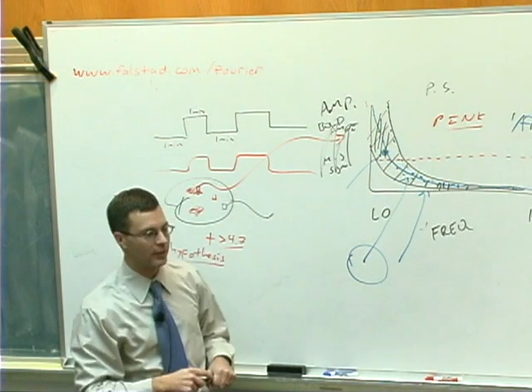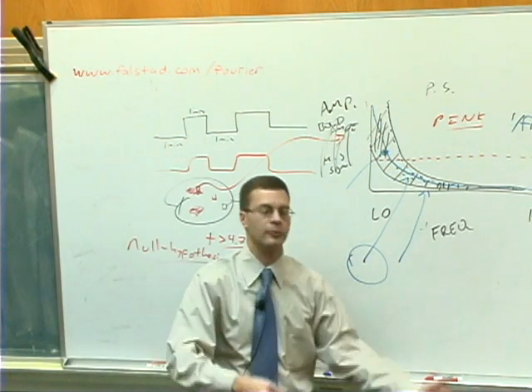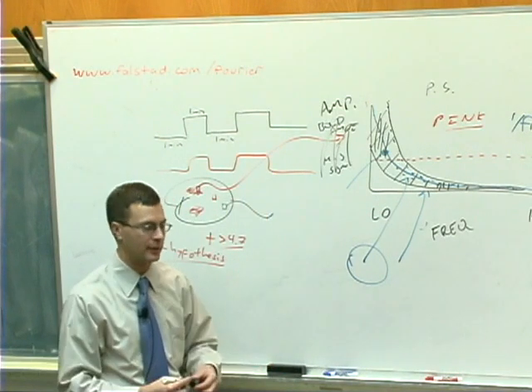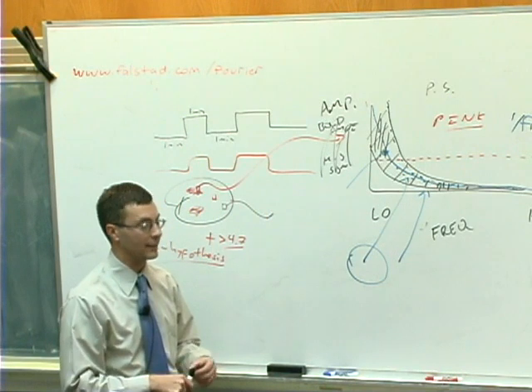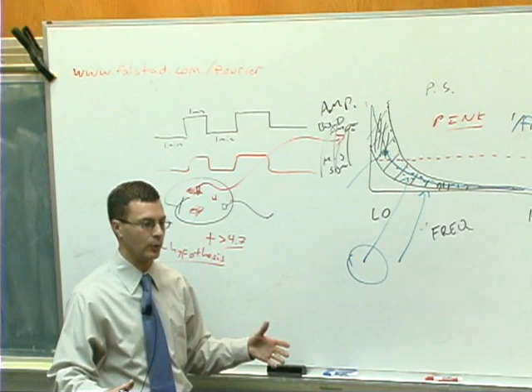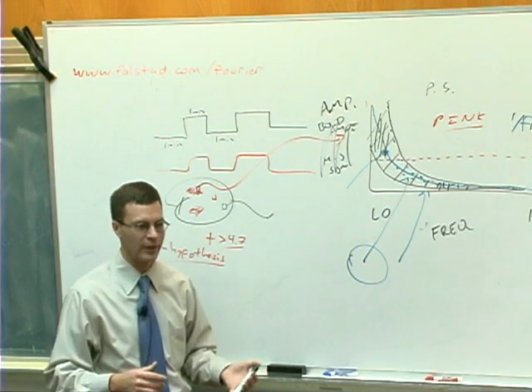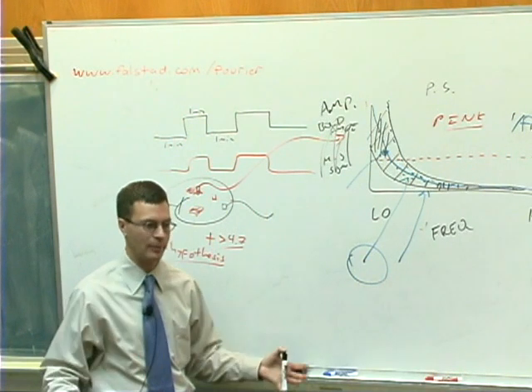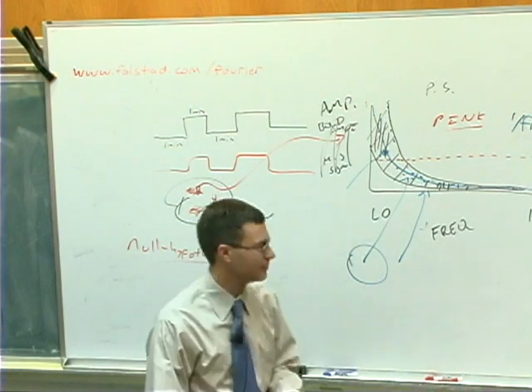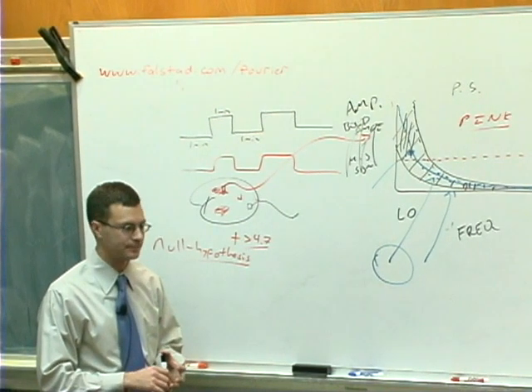If you make a map of this, it isn't anything consistent. It isn't, for example, always the ventricles that have the 1 over f noise, or always the gray matter, or always the white matter. There doesn't seem to be any clear tissue segmentation associated with it. There are definitely areas of the brain, like near the edges, that can have other superimposed noise as well, from movement and pulsatile artifacts and things like that. But in general, the 1 over f noise is not smoothly contained to different tissue compartments. It's just everywhere. It's a real pain in the butt. In fact, you can see heterogeneity even in water phantoms as well.